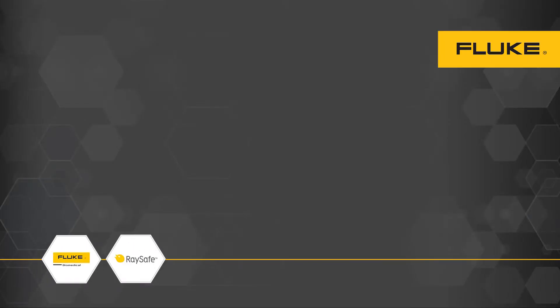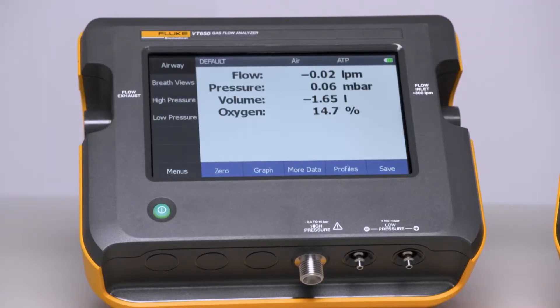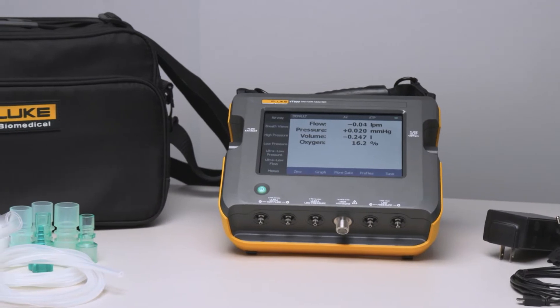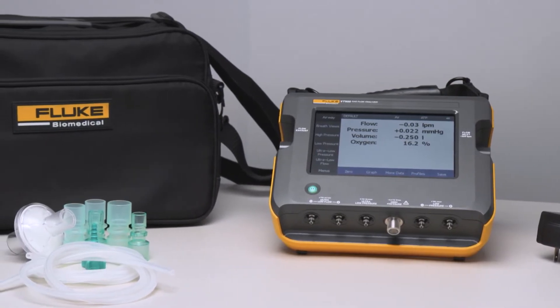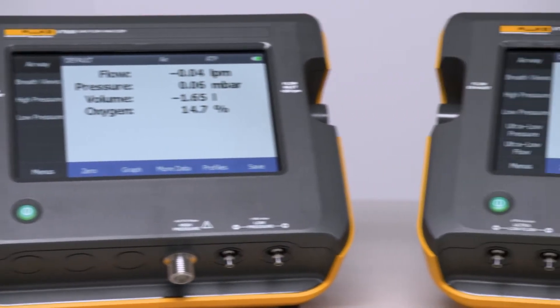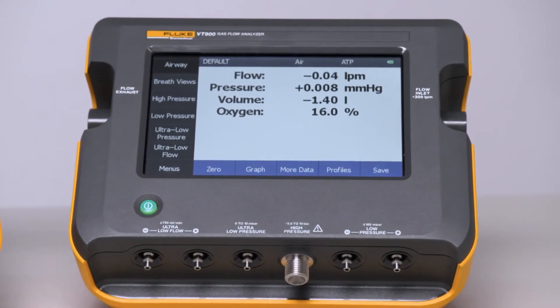We'd like to introduce you to the new Fluke Biomedical VT650 and VT900 gas flow analyzers. These devices are accurate, reliable, and all-in-one, built for testing medical respiratory equipment, including all types of ventilators, anesthesia machines, CPAP machines, flow meters, and more. Compact and portable, the VT650 and VT900 are perfect for both benchtop testing as well as on-the-go testing in the field.